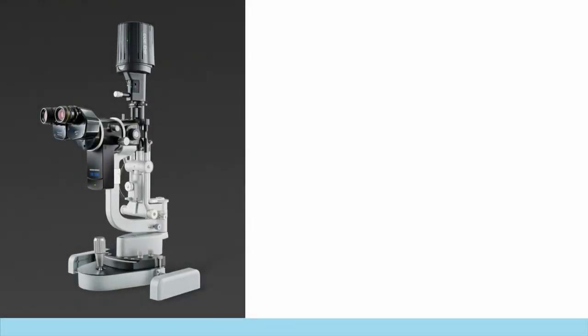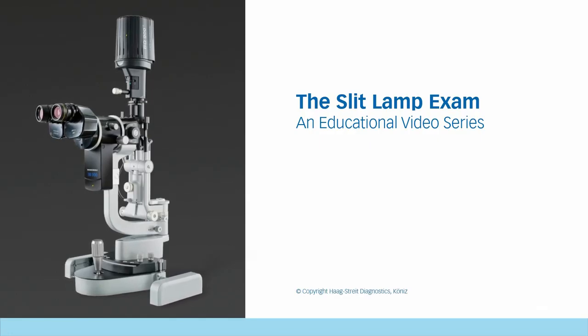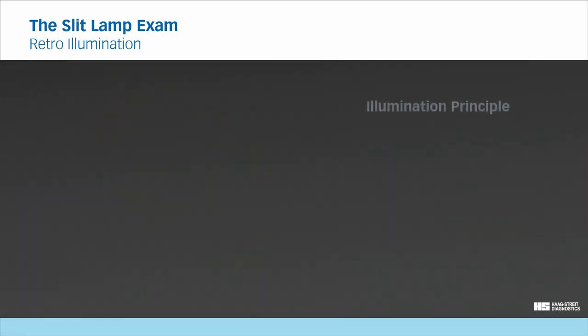Welcome to the video series, The Slit Lamp Exam. This video explains the use of retroillumination in the slit lamp exam. It covers the following topics: Illumination Principle, Usage, Specific Advantages, Slit Lamp Setup, How to apply the technique, and Common Errors. Illumination Principle.